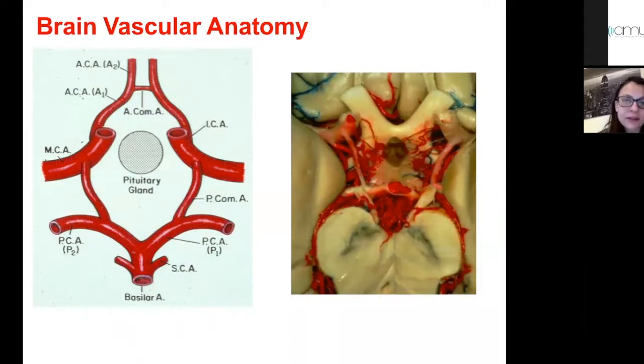Unfortunately, in the clinical practice and in reality, it's not that easy to find a perfect Willis circle, because in 70% of the patients, there is an abnormality of the Willis circle. By the way, TCD is based on the insonation of these main vessels. The Willis circle is the anatomical structure, which is made by two compartments: an anterior compartment, which is made by the ICA, MCA, ACA, and ACOM-A, here, as you can see by the arrow, and the posterior compartment, which arises from the basilar artery, the vertebral artery below it, and the posterior cerebral arteries.